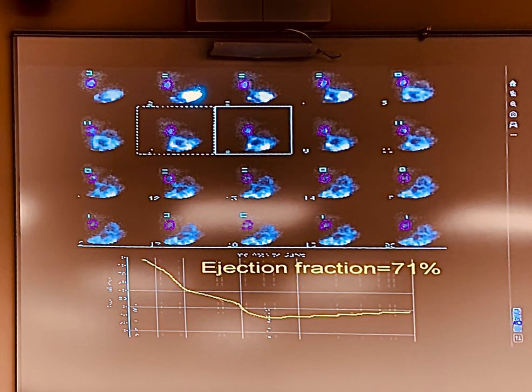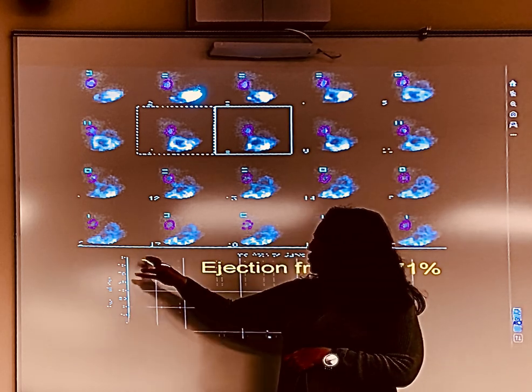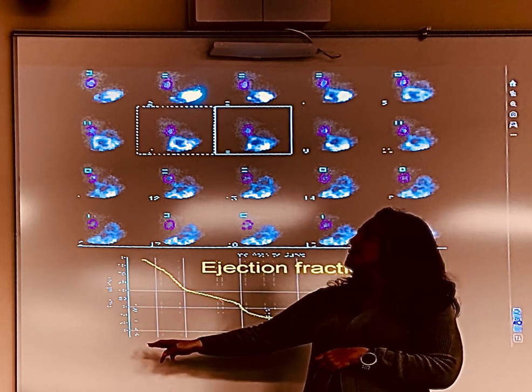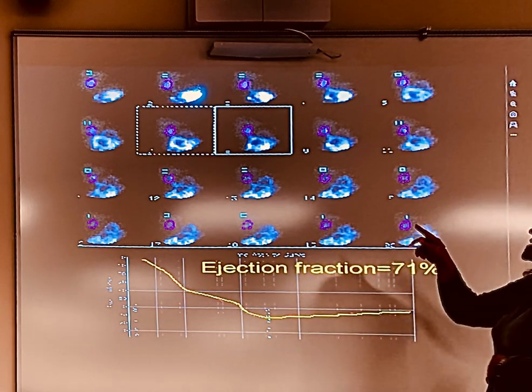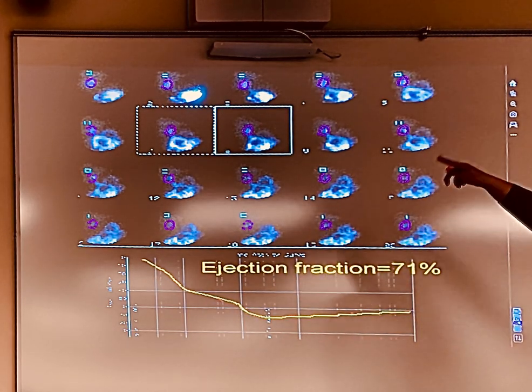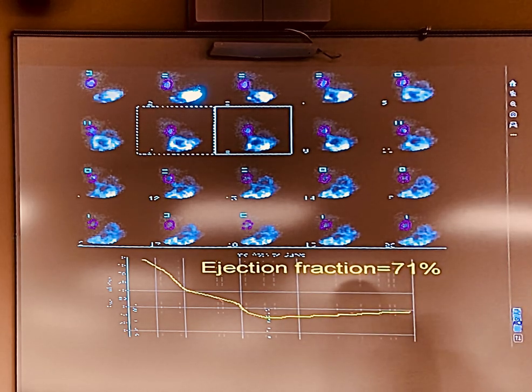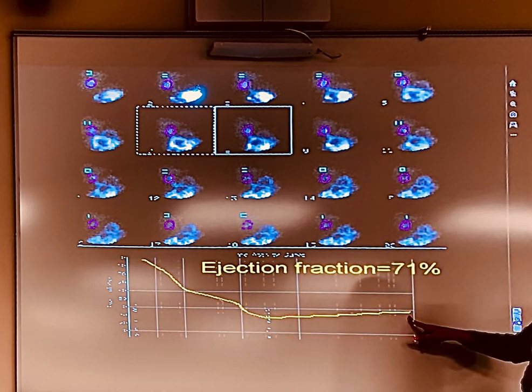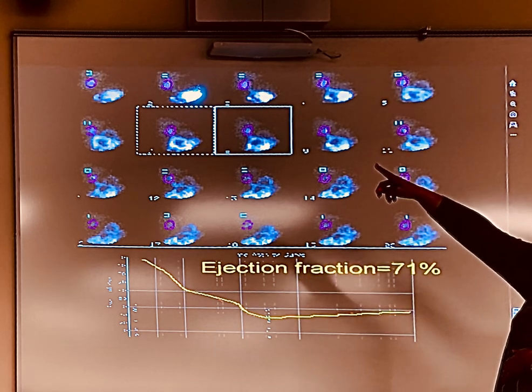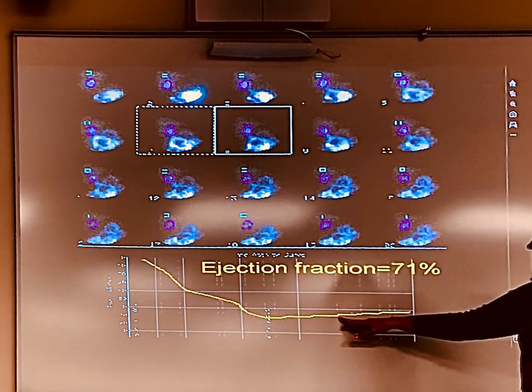So this is more typical of what it will look like. See how you have no noise over here? Your graph pretty much starts here. So that's your image 1, and here is all of your imaging, and it kept your region for each one. And then it did your time activity curve. And see how you don't have a lot of refill? Because you did not have a lot of common bile duct when you gave the Kinevac. So your curve goes down and then it's flat.